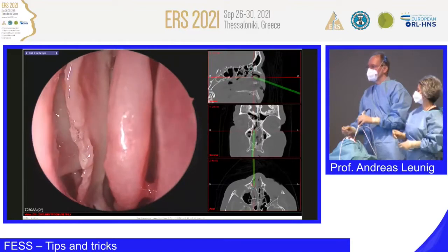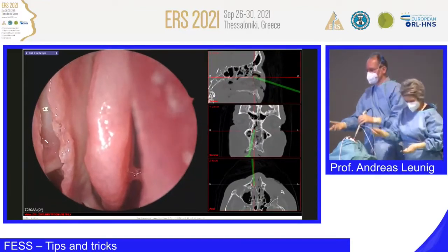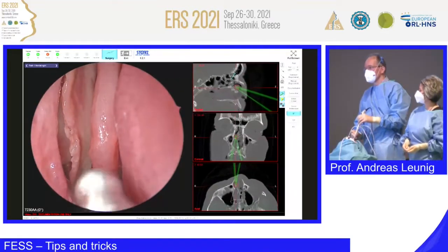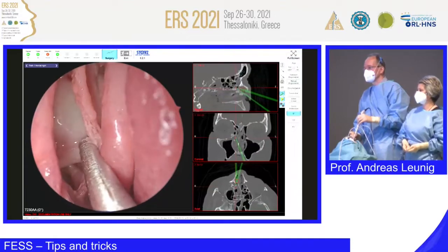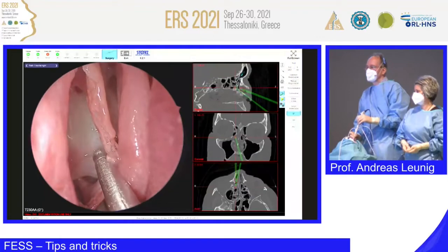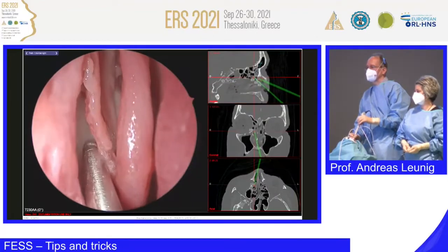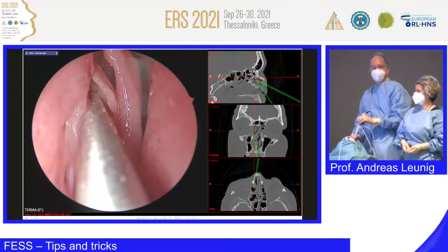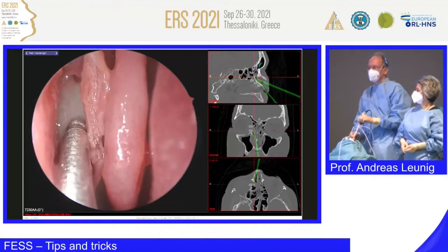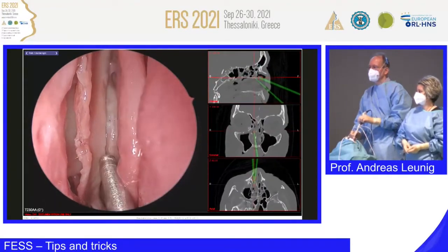Now, please give me navigation. Oh, sorry. Okay. Yes, just one second. Now we are going in, and you can see very nicely here the anterior wall of the ethmoidal bulla and the relation of the uncinate process. When I was young and started, this was very complicated for me, and I hope I can show it and you get a little bit more understanding about the relationship, yeah?